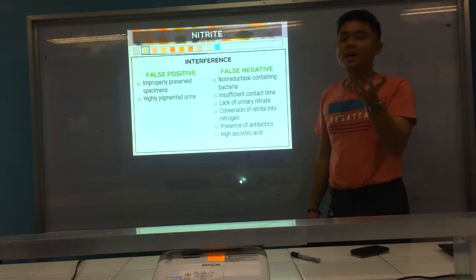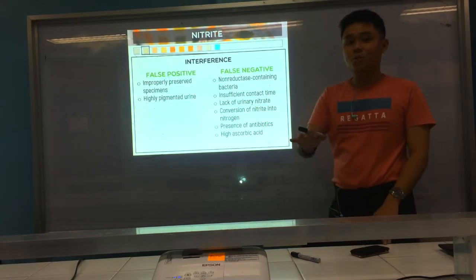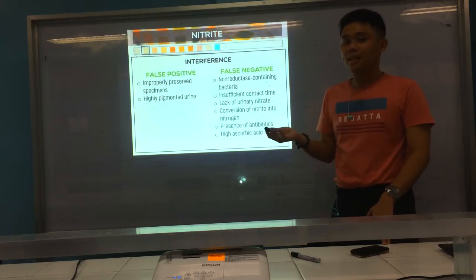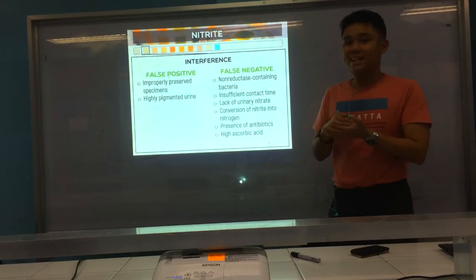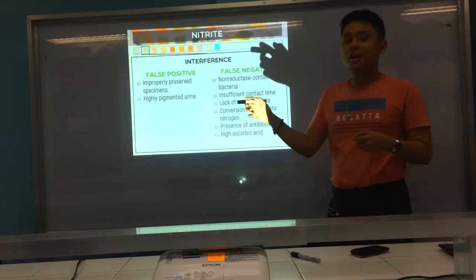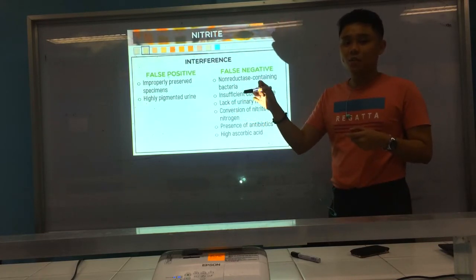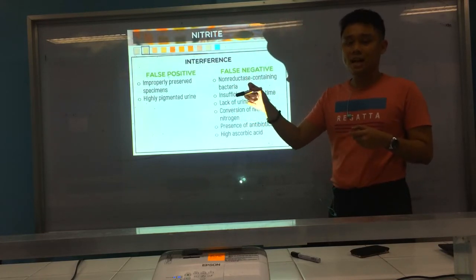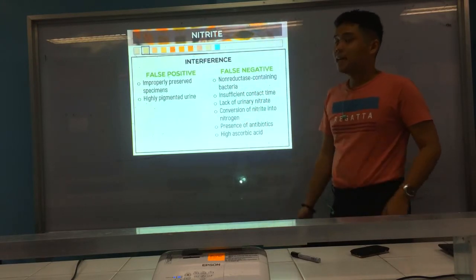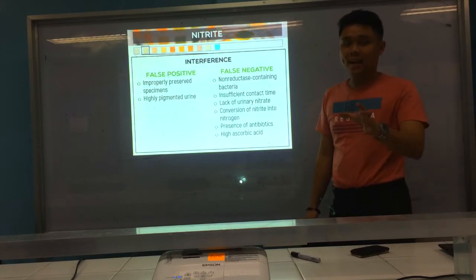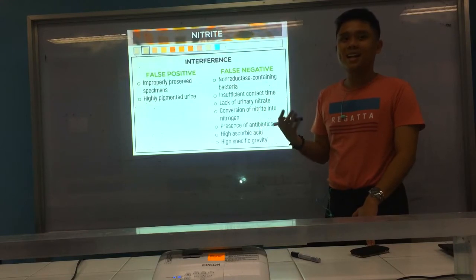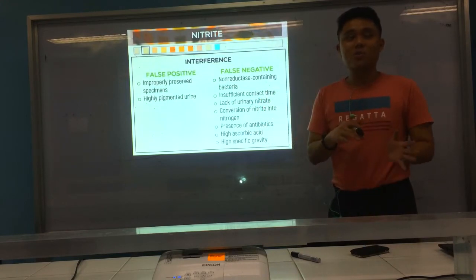High ascorbic acid causes false negatives because it competes with the diazonium salt for tetrahydrobenzoquinoline binding. Therefore, the diazonium salt formed between P-arsenilic acid and nitrite cannot be detected. High specific gravity also results in low sensitivity, as the presence of other solutes prevents detection of nitrite.